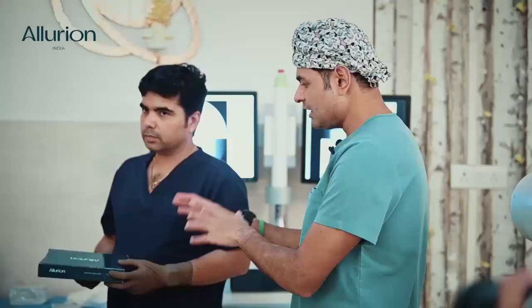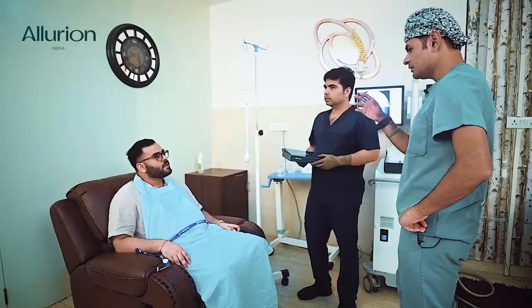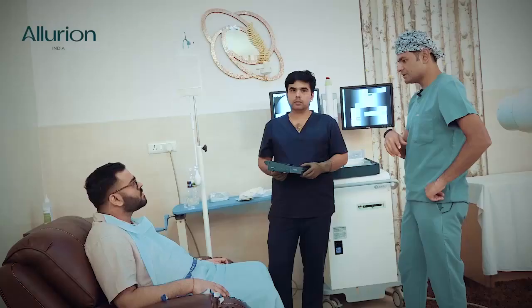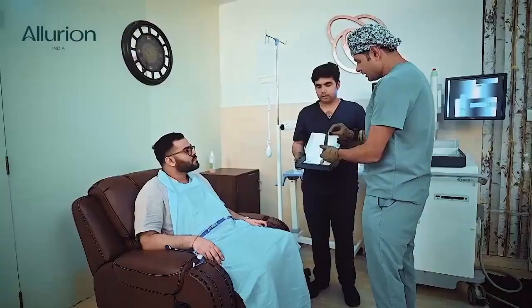The first step is I'll explain it to you, then I'll put the capsule inside. We'll take an x-ray, then once we have done the x-ray we'll initiate the filling. Once the filling is done I'll again take an x-ray and then remove the catheter. This is the Illyreion gastric capsule.